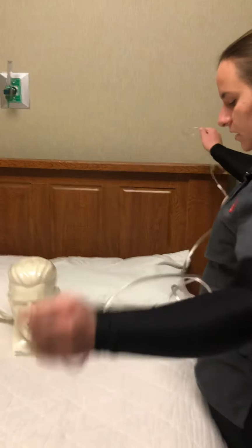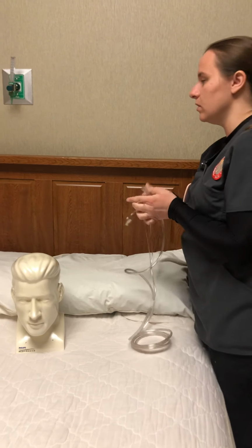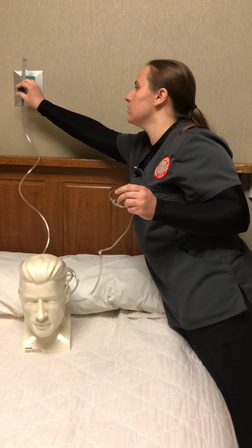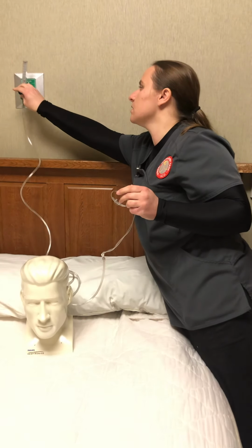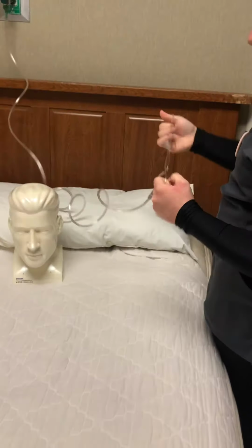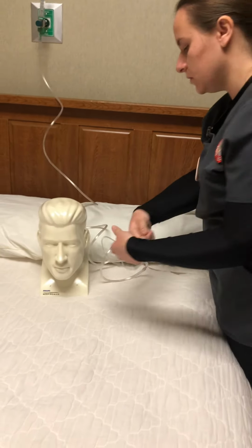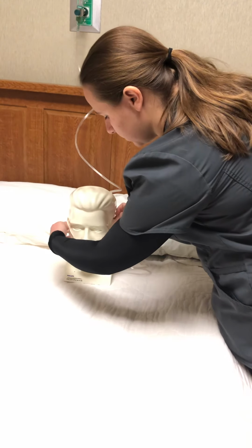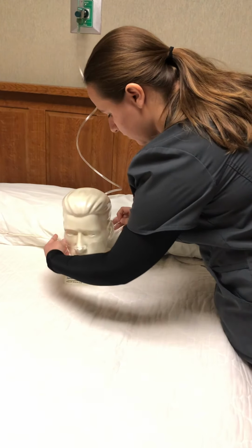Alright, so here's the nasal cannula. I ask that you don't move it from your nose or move it off of your ears because it can cause sores to your ears. So I'm just going to start this at 4 liters per minute to start weaning you off of oxygen. So I'm going to place this into your nose. And like that. We'll place that around your ears.